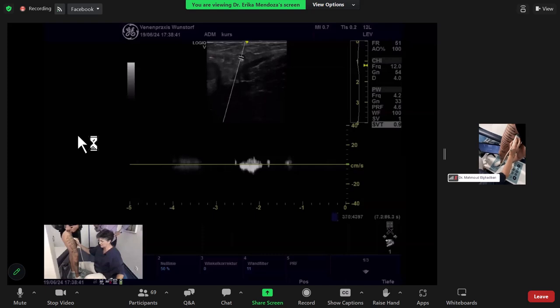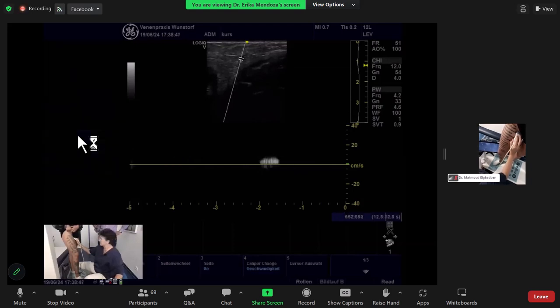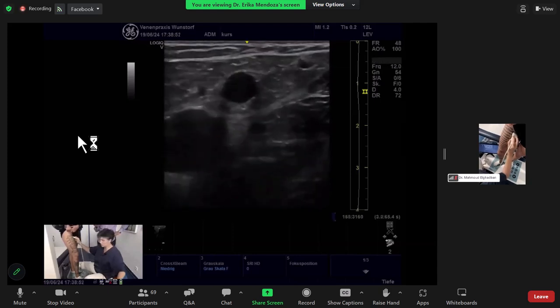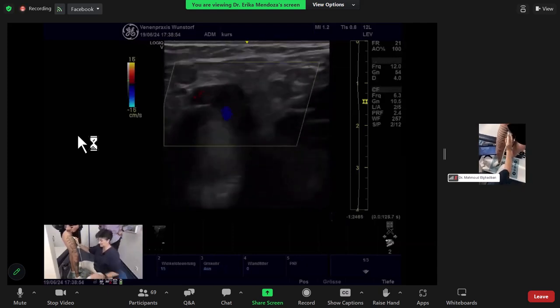Sorry, I will try this one. Lift the toe once and lower it. It's not as clear. So now we will do another thing. We will look in color, which sometimes helps.